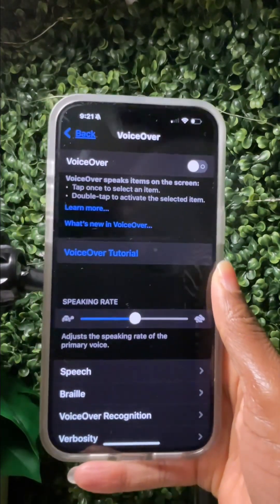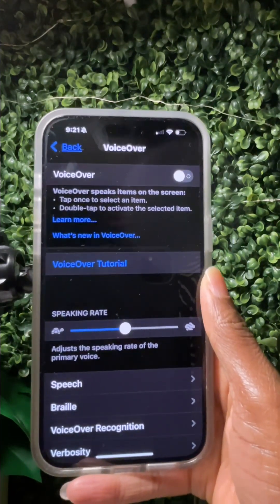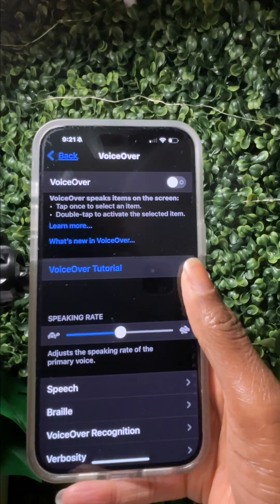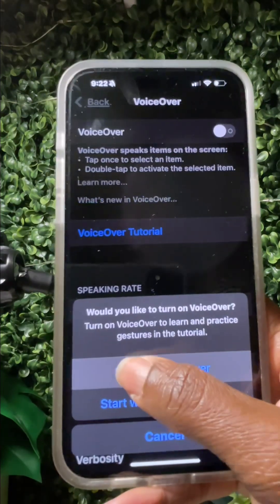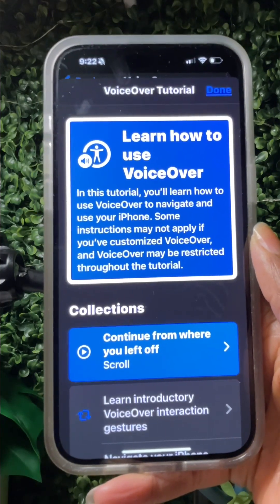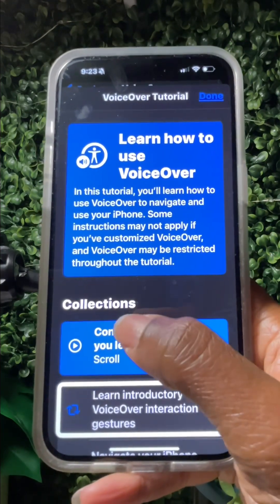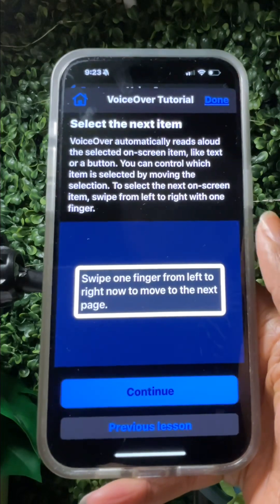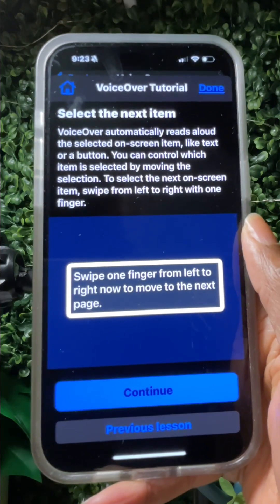If your device is running iOS 18 — which is a newer version, and you can have an older phone with newer software by going to Settings > General > Software Update — they have another feature called VoiceOver Tutorial. It guides you through: 'Learn introductory VoiceOver interaction gestures. Swipe one finger from left to right now to move to the next page.' VoiceOver automatically reads aloud the selected on-screen item.